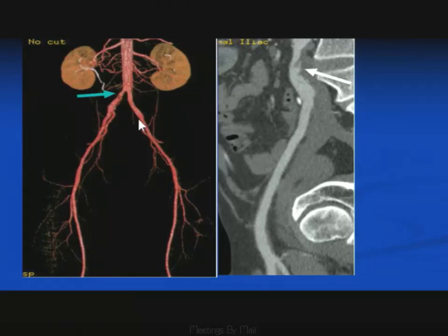Here's a patient who had the blue toe syndrome. So all the circulation distal to this particular site here looked normal. The patient was in his early 30s, but it wasn't until, again, we used a curved plane technique, appropriate rotational angle, and then we could see this patient had an ulcerated atherosclerotic plaque in his proximal common iliac artery that had thromboembolized down to his toes. So that's the value of the technique in being interactive in the workstation, rotating, clearly demonstrating where the pathology is.